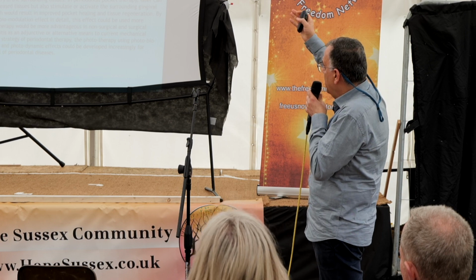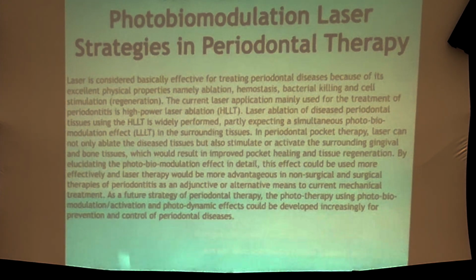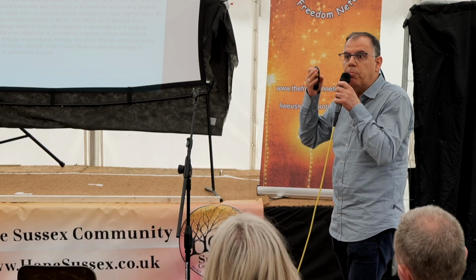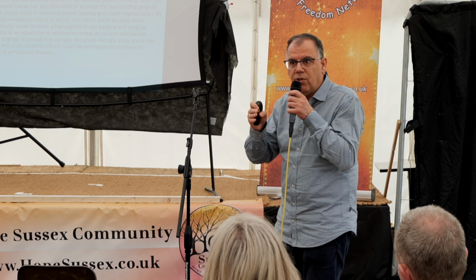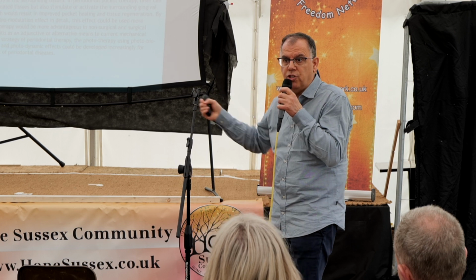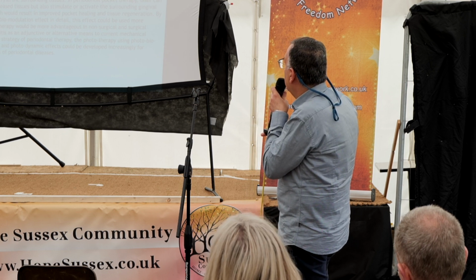So the low-level laser application, okay, for the surrounding tissue of the tooth in the periodontium, is helping a lot, based on so many studies here, as you can see. It is considered effective for treating periodontal disease because of its excellent physical properties, namely ablation, hemostasis, bacteria killing, and cell stimulation, regeneration, or proliferation. Does that make sense for you guys? So this is the only tool that can proliferate and regenerate tissue because of its unique specification. All right?